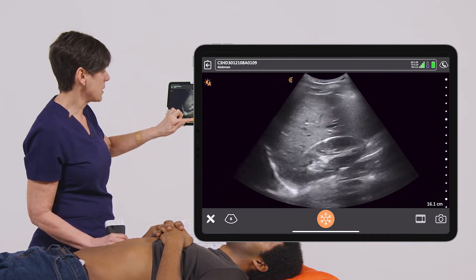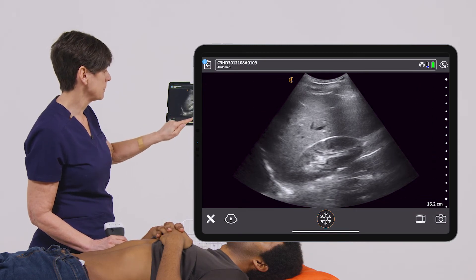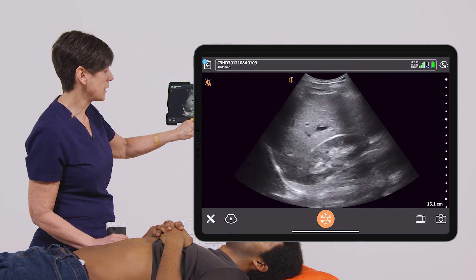If I want to freeze my image, I can take an image as a still picture with the camera, and then unfreeze. If I want to do a cine clip, I just click on the film strip.